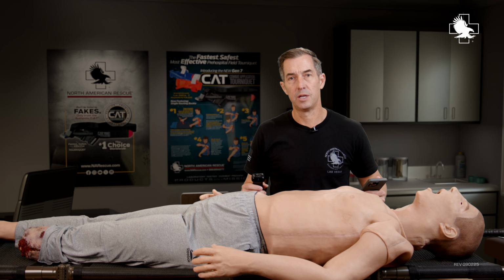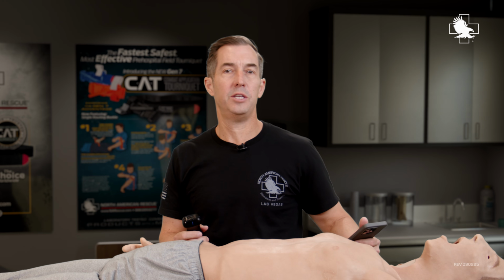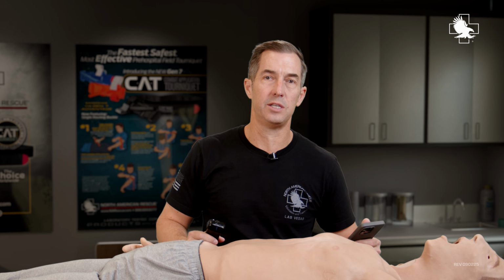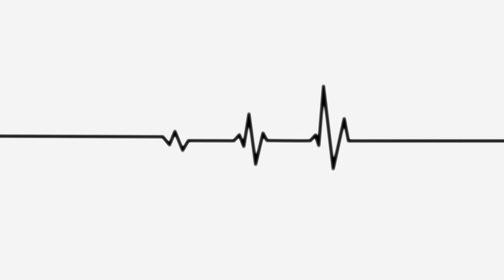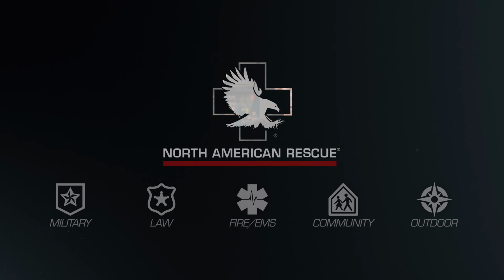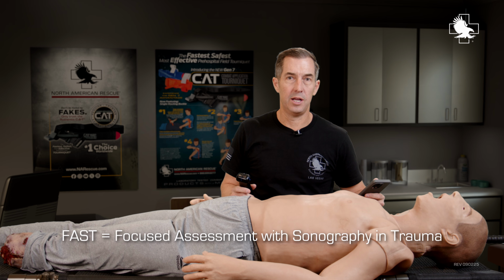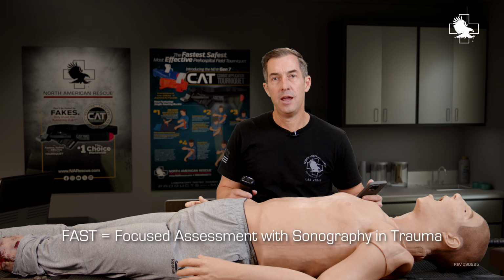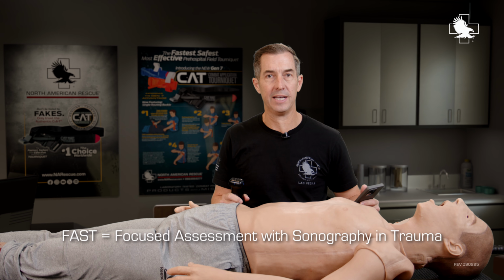Today I'm going over some of the uses of ultrasound in the pre-hospital setting with your patients. So one of the most common and well-known uses is doing the FAST exam or the eFAST exam. Very simple exam to learn, takes a few practice runs, and then you're able to identify hemorrhage within the abdomen. So I'm going to focus on the abdominal portion of the FAST exam today.